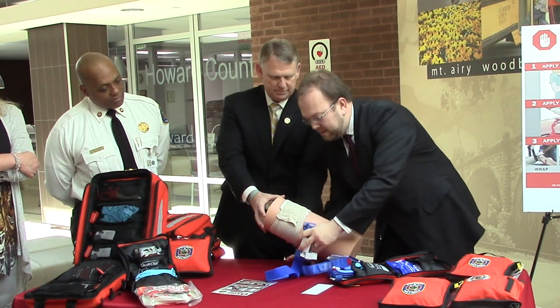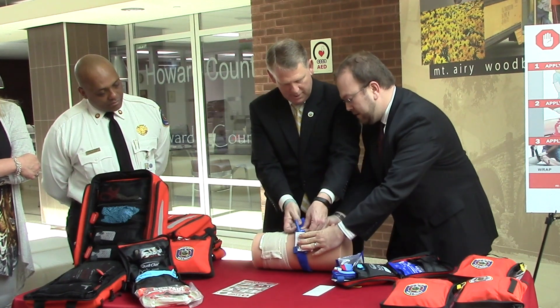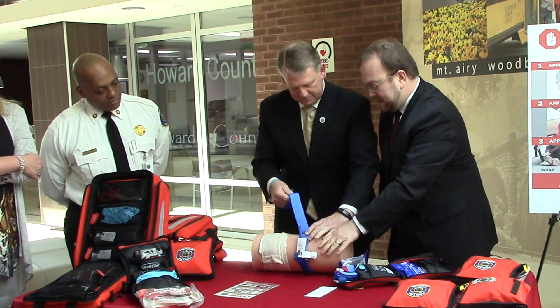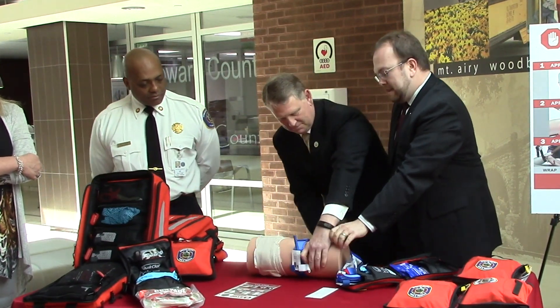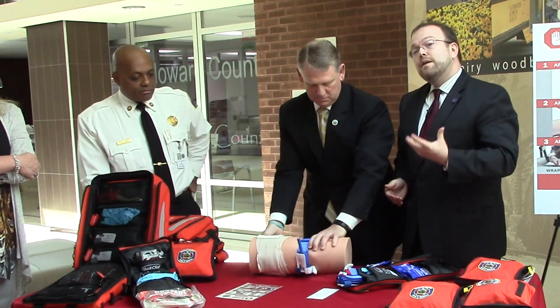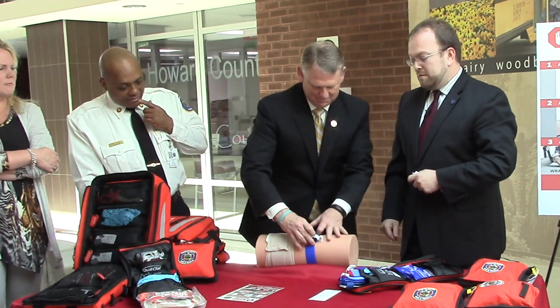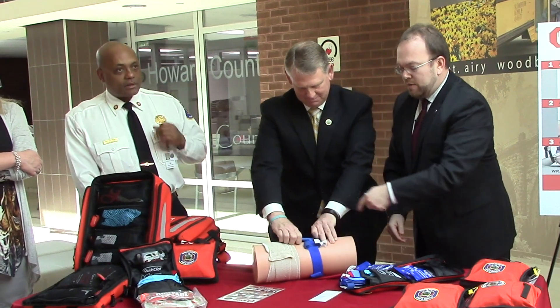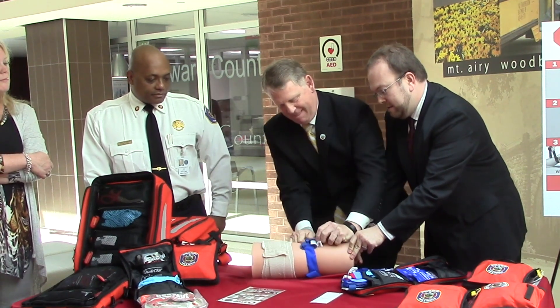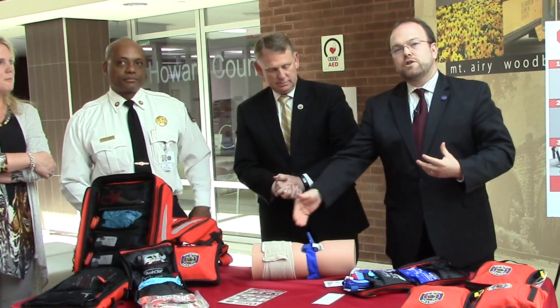We want to shut off that bleeding vessel, so we have to go above the level of the injury, closer to the heart and more central to the body. We can slide it over top or feed it around like this. Feed that loop through there, right through the bottom, coming up like that, and pull nice and tight. This is the most important step — pulling that as tight as possible. This hurts; this is not a fun thing for the patient to go through. We wrap that, and now we're going to start spinning that windlass rod. Keep spinning — and one more good spin. That is now sufficient to control the severe bleeding.